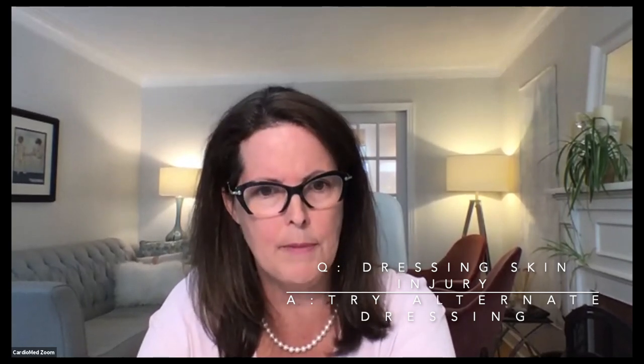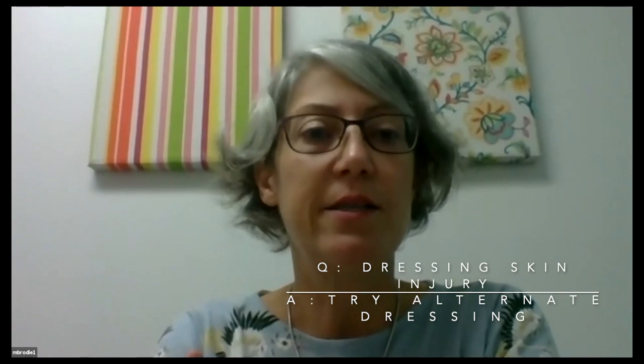Do you wait if your assessment indicates no further complications? Do you change it once a week, or how often would you change that? Once a week is ideal. It really depends. Some of those dressings don't stay very secure on the client, depending on their level of activity. But we have had clients where that dressing can stay in place for 7 days and it's been okay. As long as the insertion site and the line are covered, there's no drainage on the outside, the client isn't showing signs and symptoms of any kind of infection, and there's no pain at the site with gentle palpation, we do try to leave that in place, because otherwise you're just ripping that dressing off, ripping off the skin that you're trying to heal underneath.